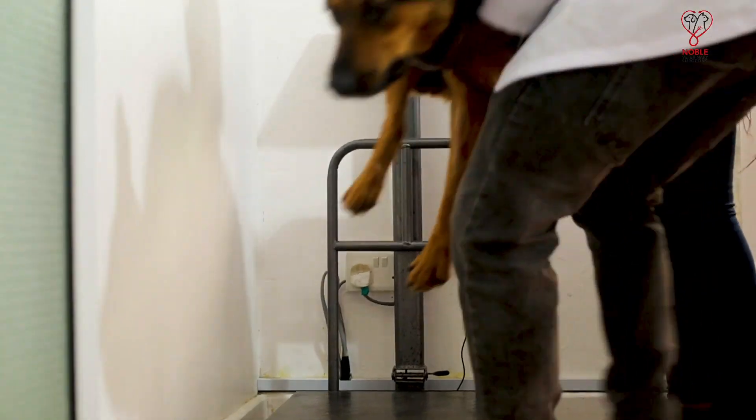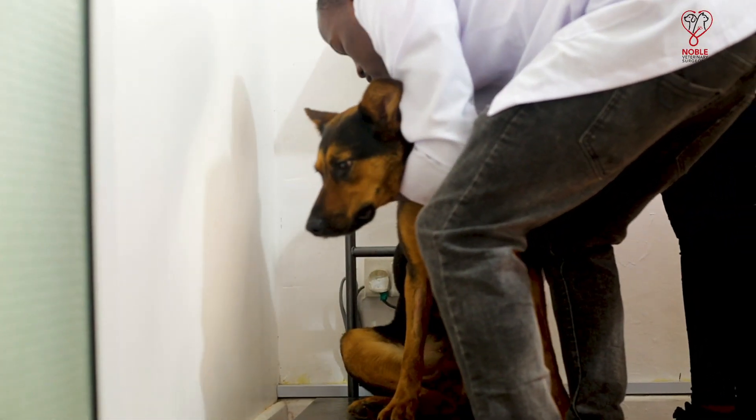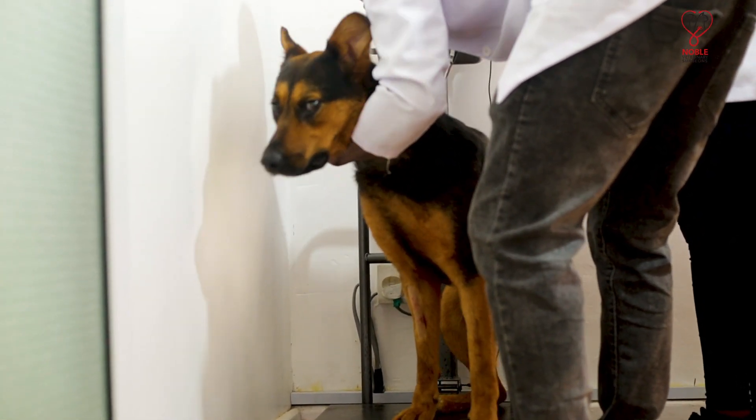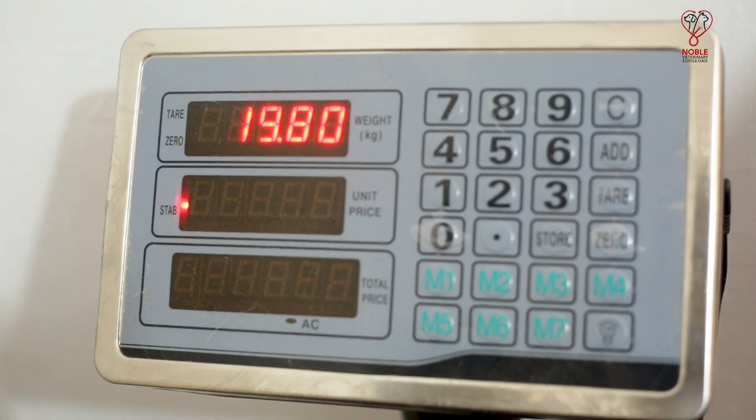We really first start by taking the weight of the animal. This aids in monitoring the growth of the animal and also in drug administration. So it's a very important parameter to be checked.